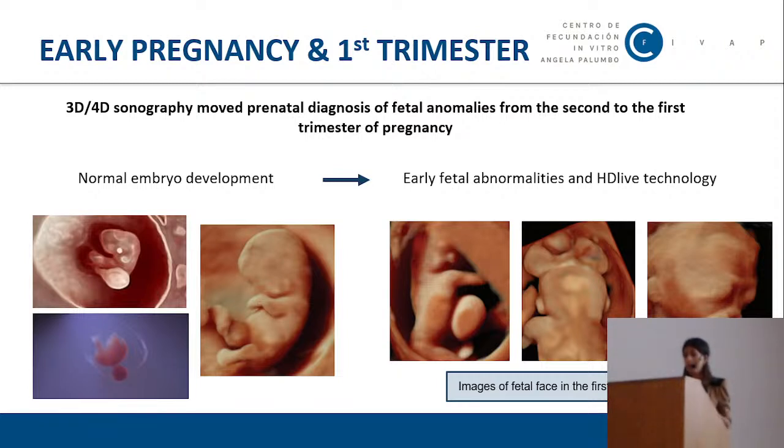For most parents, the image of the fetal face at this stage appears to be strange, and it can create a distorted image of their child. So try to show a lateral view of the whole body instead of amplifying the screen, trying to zoom on the face, because usually they don't like it at these early stages.